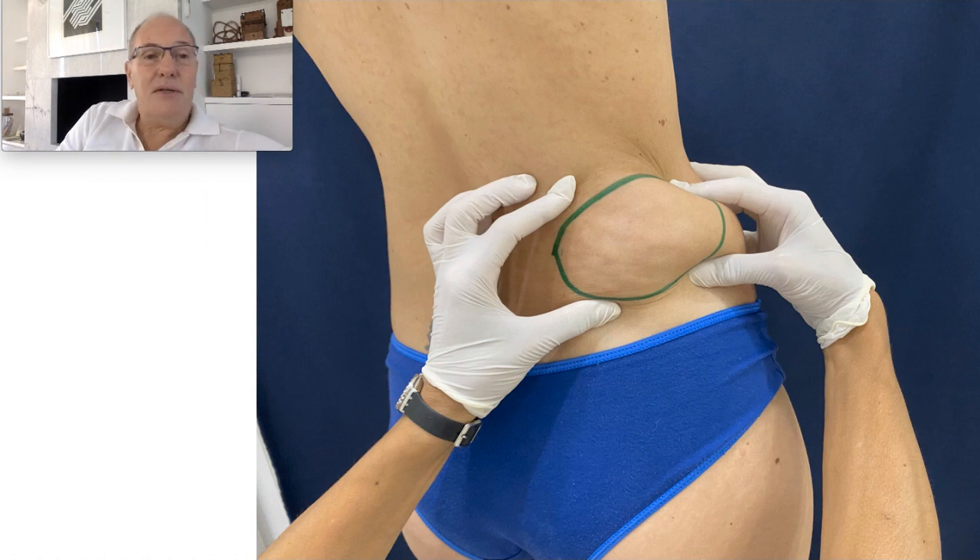I am a general surgeon, I am a reconstructive surgeon, and I developed a technique where I make a small incision, 2 cm in the middle of the tumor, and from this incision I can remove the full lipoma.